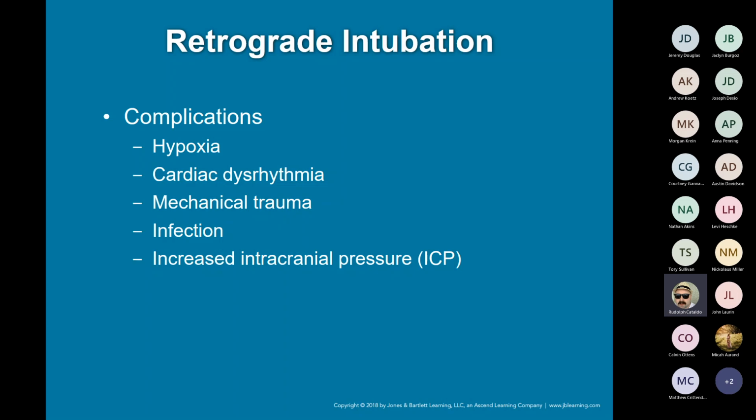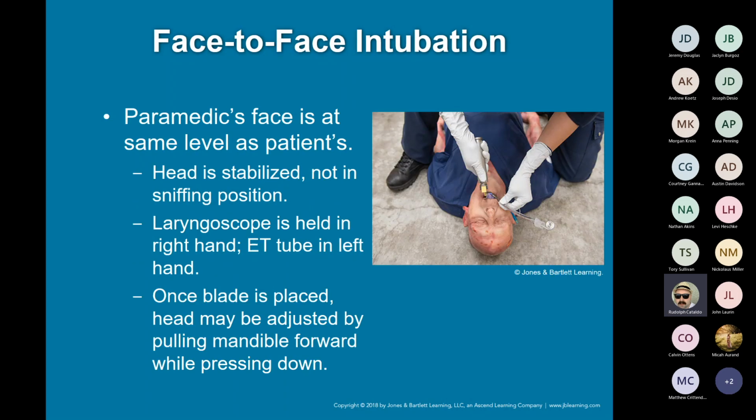We also have what I call ice picking, what they call face-to-face intubation. I've seen this done once in the field, where essentially you're looking at the patient. If you and I were having a conversation, sitting straight across from each other, you could intubate me in that position. A lot of times this is used during severe traumas like car accidents, where it's going to be a prolonged extrication, getting the person out of the vehicle.